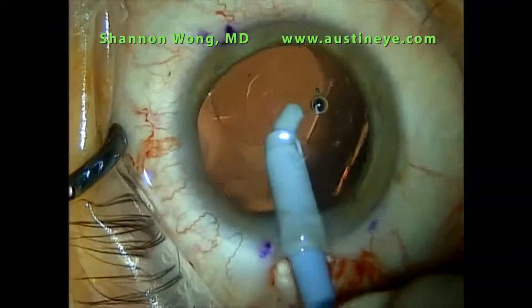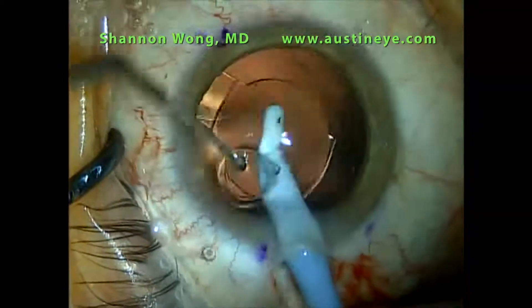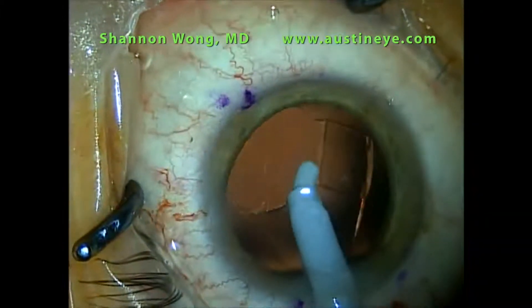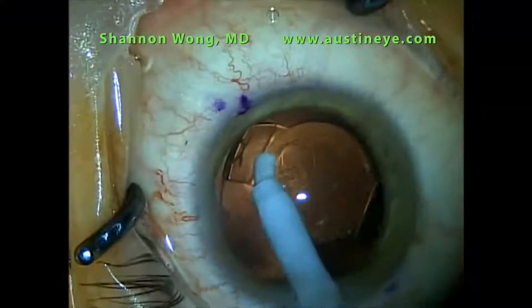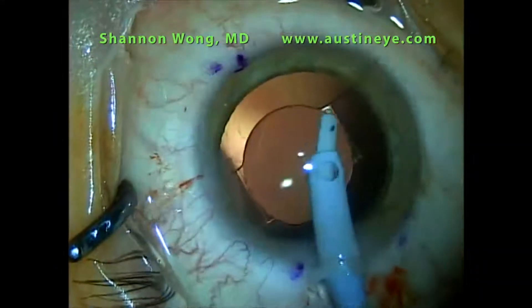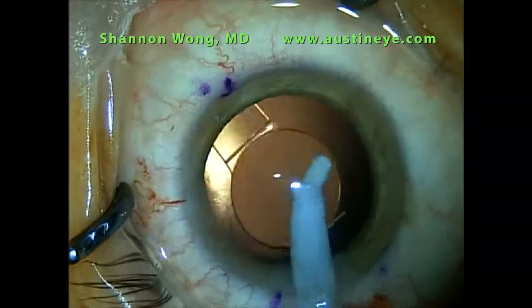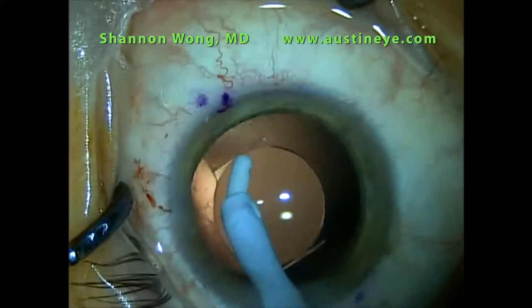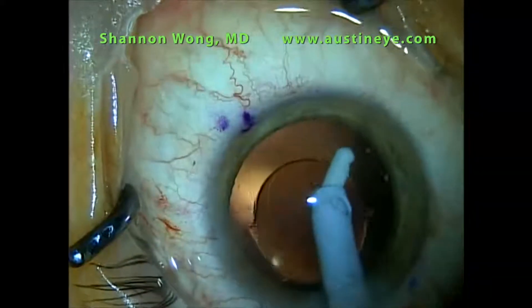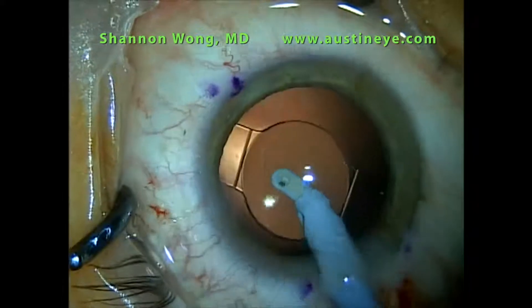Then I rotate the lens toward that haptic and the final haptic goes underneath the anterior capsule leaflet. Our entire IOL is now inside the capsular bag and I then remove the viscoelastic. I always spin the CrystalLens around to facilitate removal of any equatorial cortical fragments, remnants, or strands that remain at the end of the case. Spinning the lens also helps to free up any viscoelastic, so I want to make sure my IOP doesn't go too high afterwards. This concludes my technique for insertion of the CrystalLens AO using the CrystalCert.